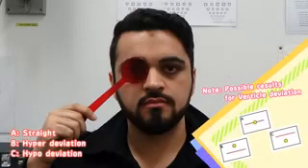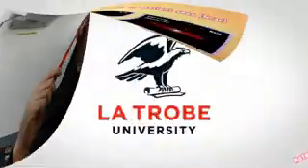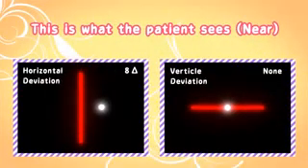To measure the vertical deviation at near, the patient is asked to hold the Maddox Rod in front of the right eye with the cylinders vertical. Therefore, the red line will now be horizontal. The patient is asked whether the white light is superimposed on the red line or if it is above or below the red line. In this case, the patient has indicated that the white light is superimposed on the red line, meaning that they have no vertical deviations.